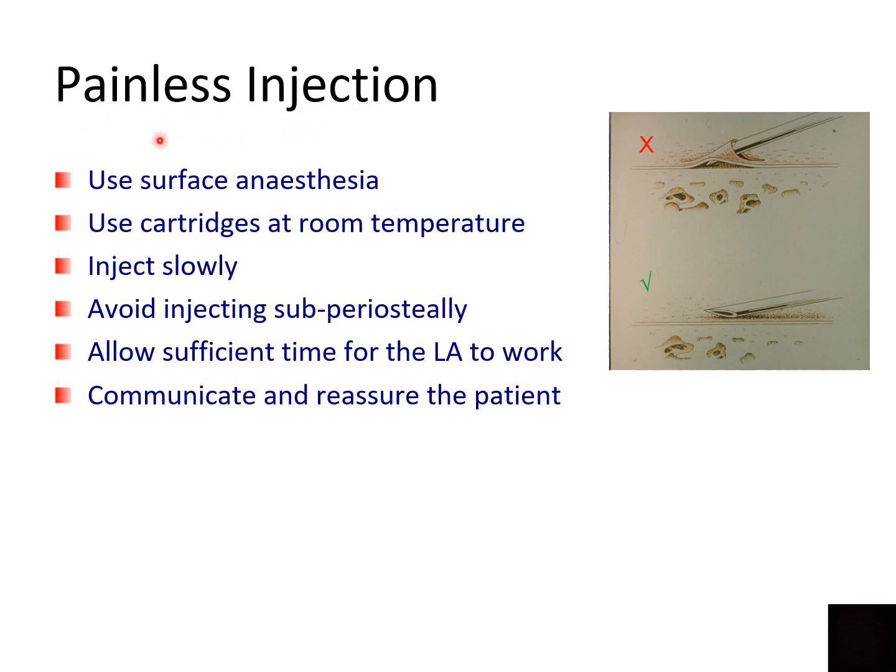So, some of the things which may help you minimize the discomfort associated with local anesthetic injections in dental practice are firstly the use of surface anesthesia. Now, surface anesthesia is usually very helpful with infiltrations. It may not be so effective with ID nerve blocks, but the least it does is it reassures the patient that you are caring and you are trying your best to look after them.